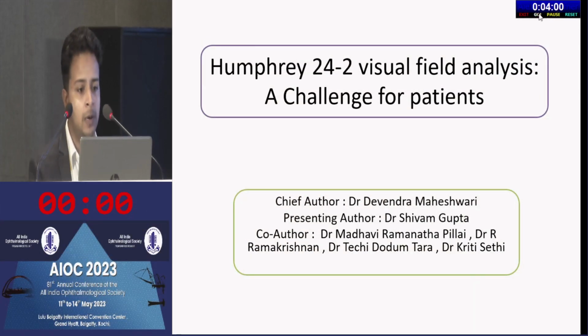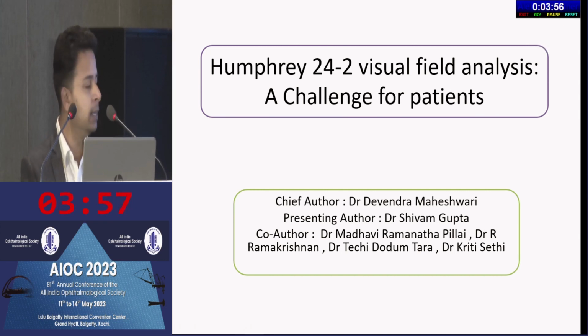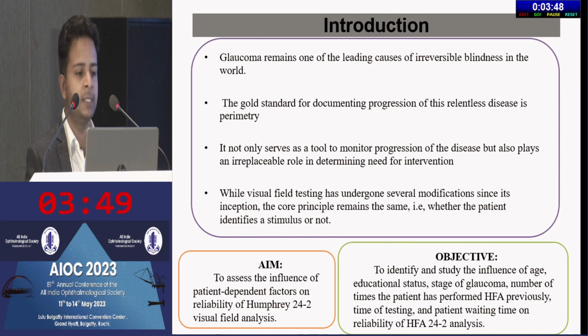Very good morning to all. Today, my topic of discussion will be Humphrey 24-2 visual field analysis, a challenge for the patients. Glaucoma remains one of the leading causes of irreversible blindness in the world, and the gold standard for documenting progression of this relentless disease is perimetry.